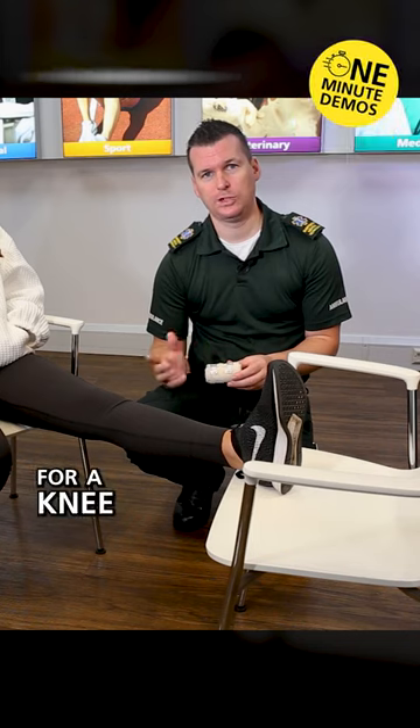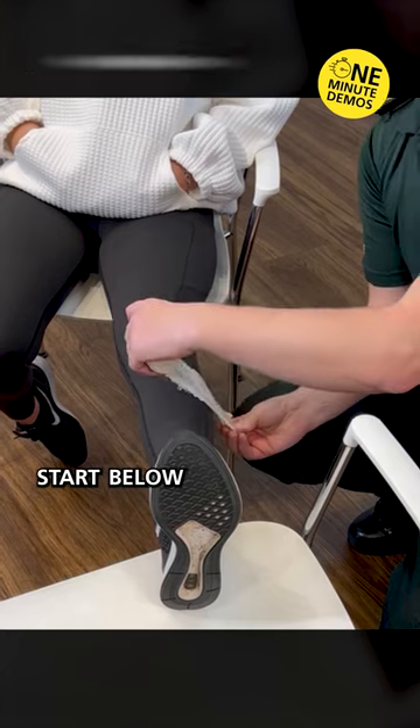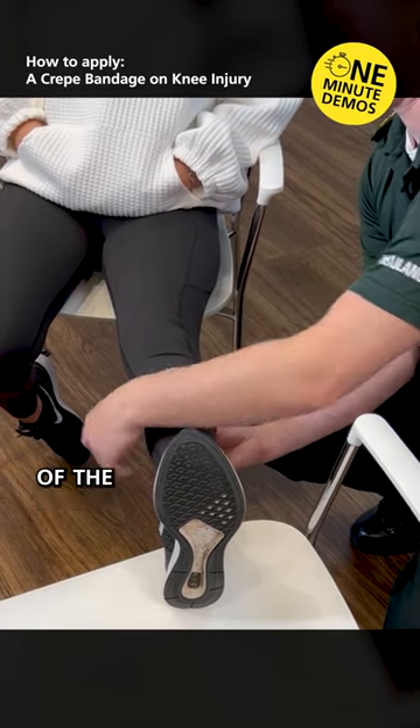This is how to put a crepe bandage on for a knee injury. Remove the clips from the bandage and put them to one side. Start below the knee at the top of the calf.